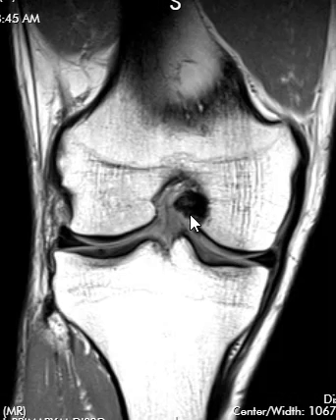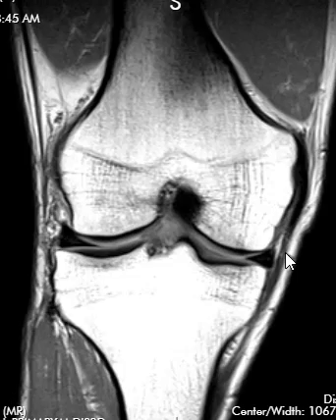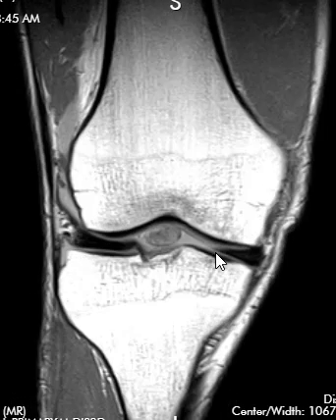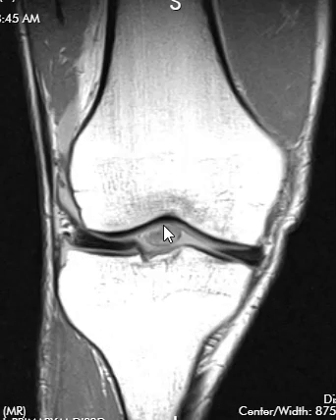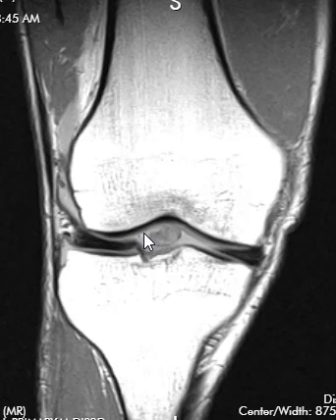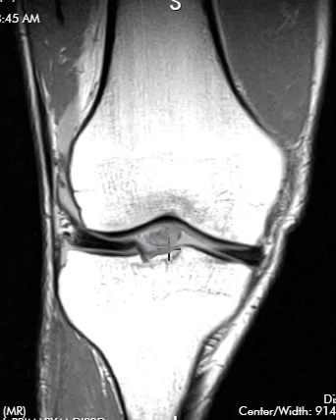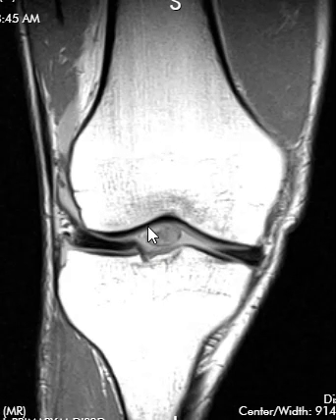Looking at the coronal image, going forwards, this funny-looking area anteriorly is again that 50% torn component that has flipped forwards into the central joint.